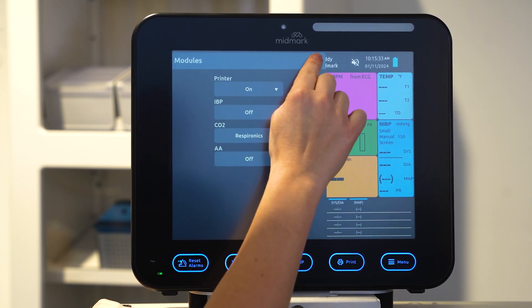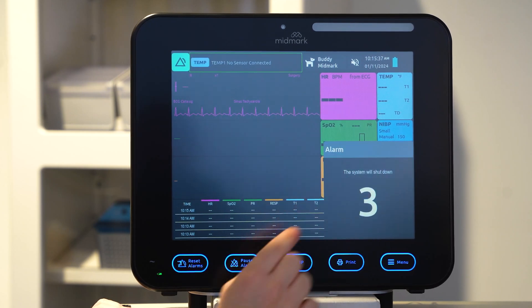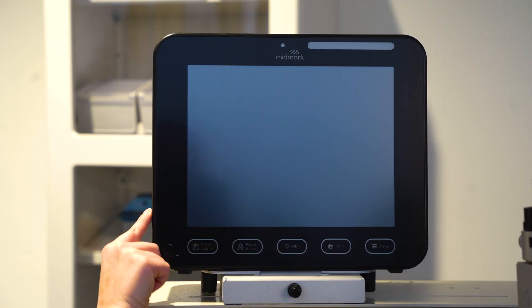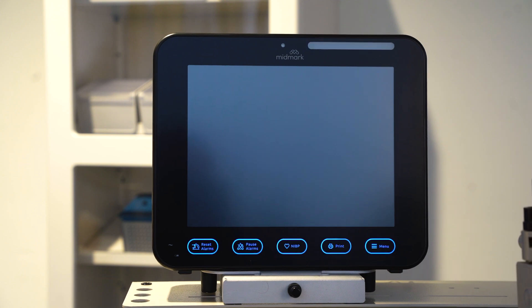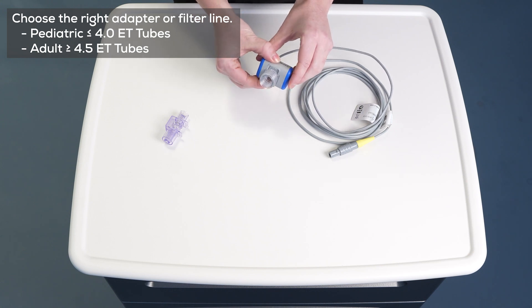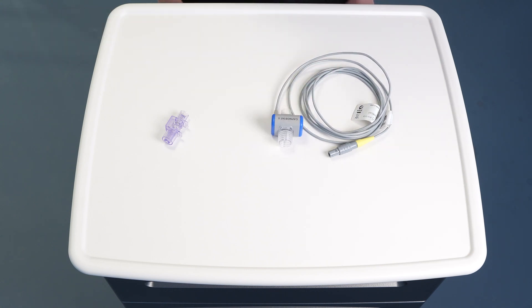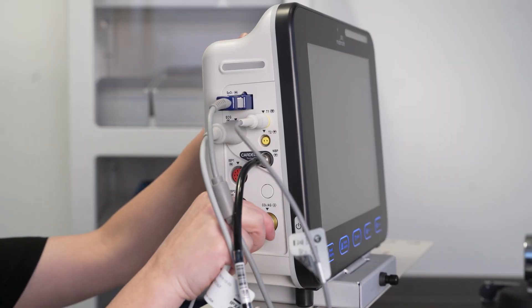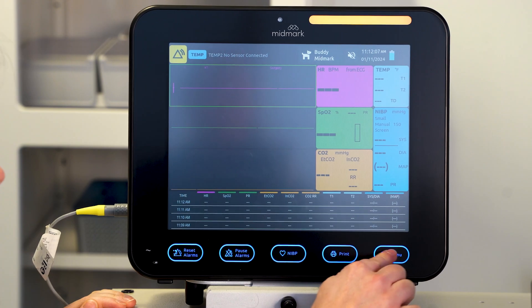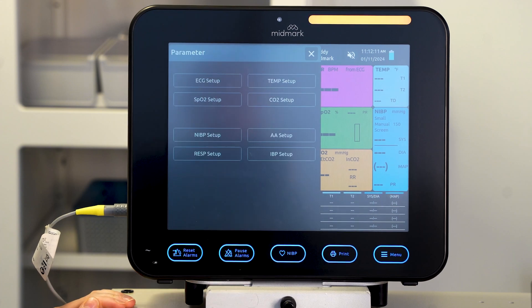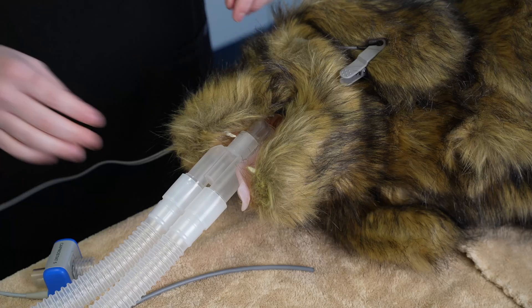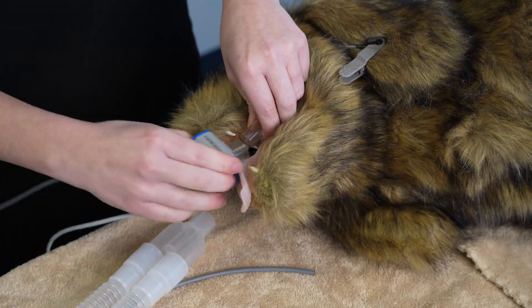To shut down the monitor, press the X in the upper right hand corner and select OK. Turn the monitor back on by pressing the power button. Next, gently insert the appropriately sized adapter or filter line into the CO2 sensor. Plug the CO2 cable into the CO2 port on the side of the monitor. Allow the sensor to warm up and then start the zero calibration. Press settings, select parameter setup, select CO2 setup, and press start zero calibration. After successful zero calibration, the sensor is now ready to attach to the patient.